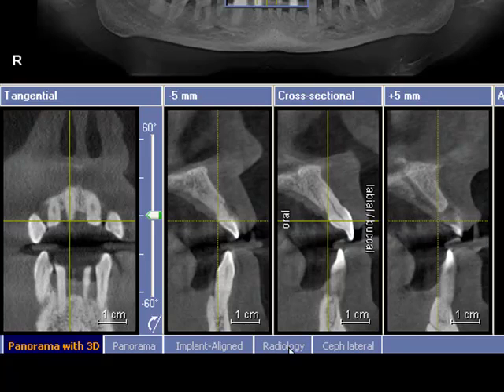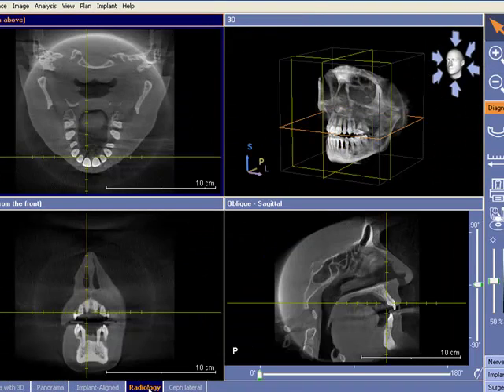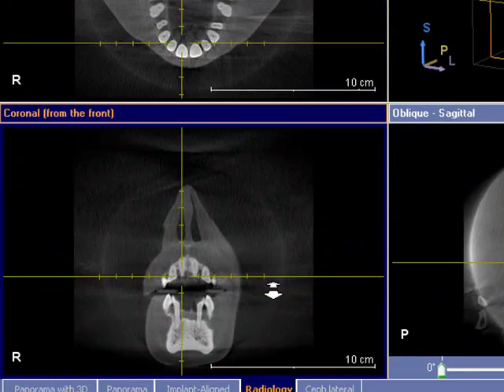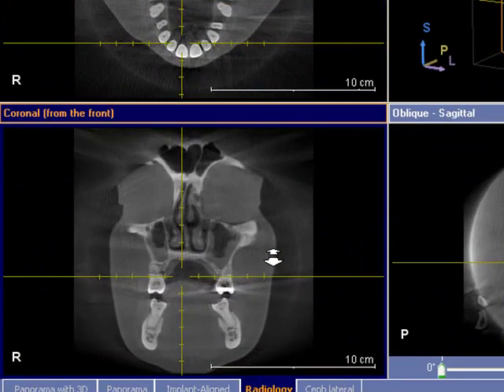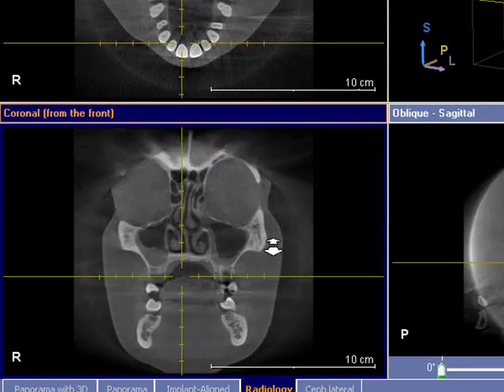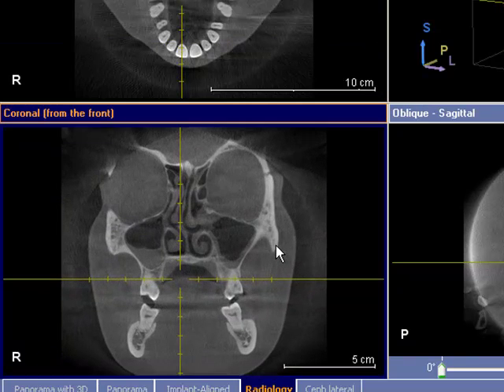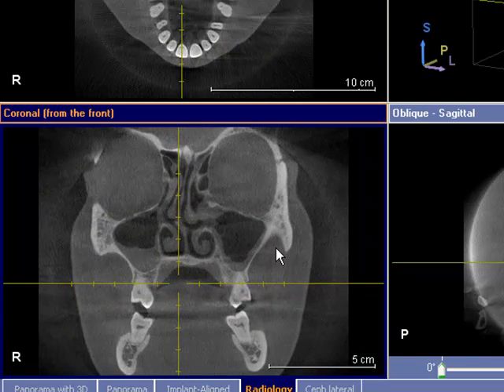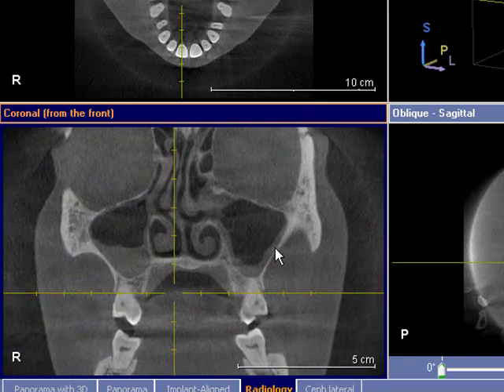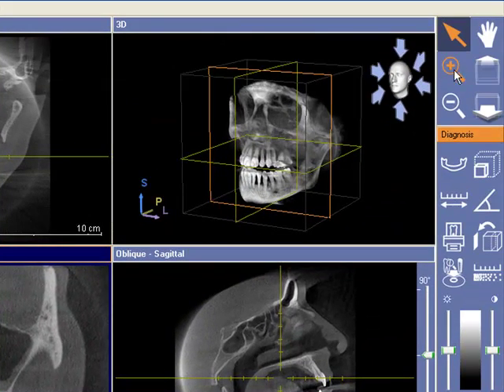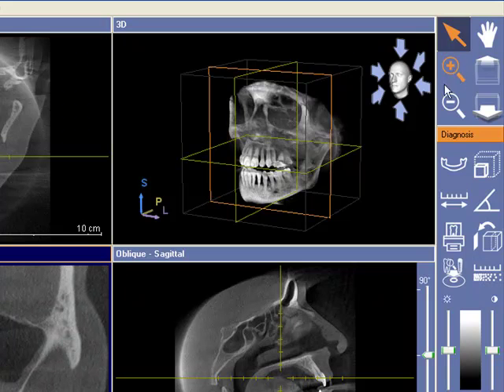Radiology is a good tab for diagnostics purposes. We can also use that one to measure, so we'll use that tab today for our example for our measuring. Now just get to your area of interest to be able to measure. Once you're there you can zoom in if needed with your mouse scroll function or with our zooming in function just here.